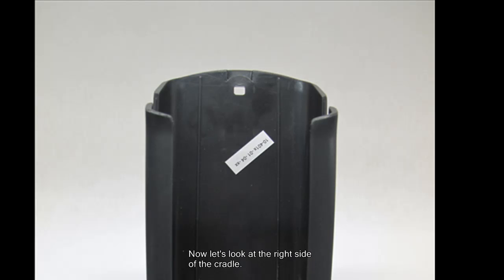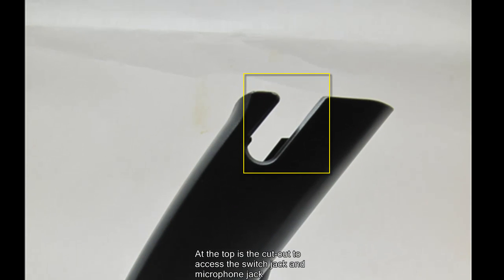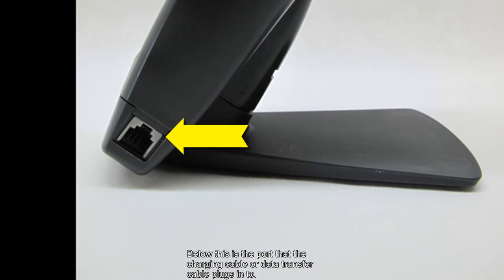Now let's look at the right side of the cradle. This is the right side of the charging cradle. At the top is the cutout to access the switch jack and microphone jack when the Sicare unit is in the charging cradle. Below this is the port that the charging cable or data transfer cable plugs into.